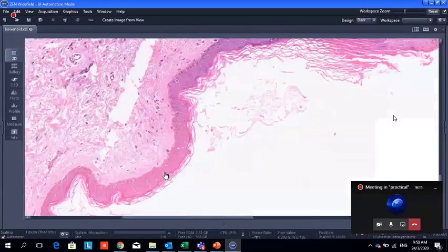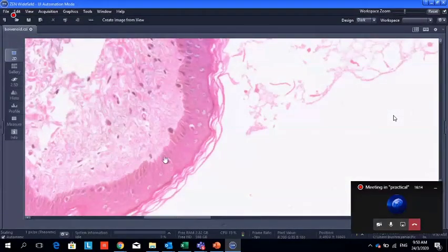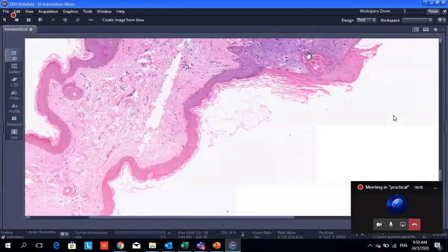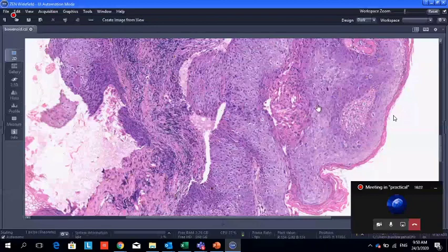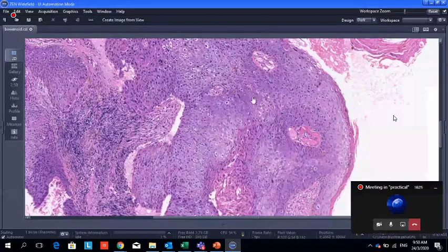The skin, isn't it? If we compare the thickness, here it's a warty lesion, so the layering of the skin is increased. But the changes are dysplastic changes. So the dysplasia involves the full thickness of the epithelium. Okay.